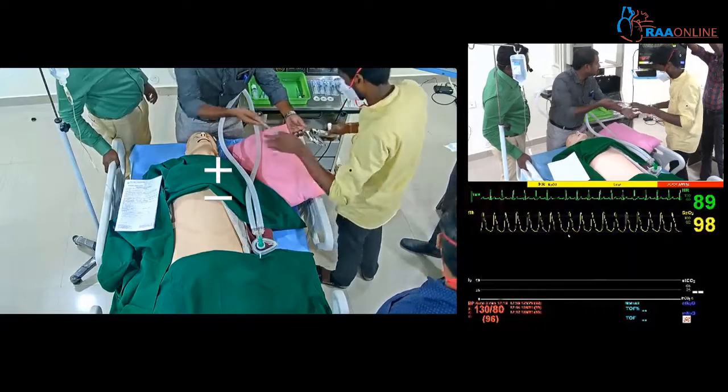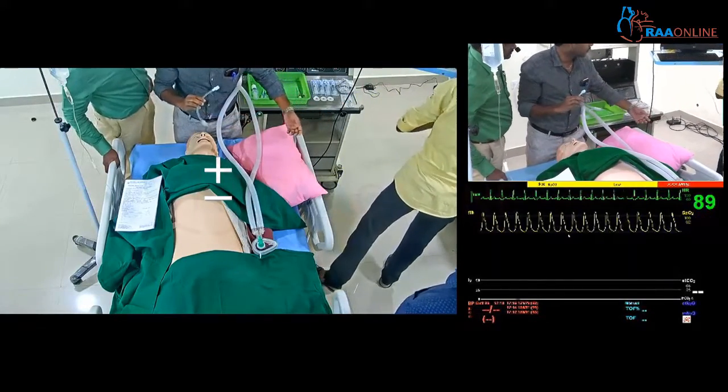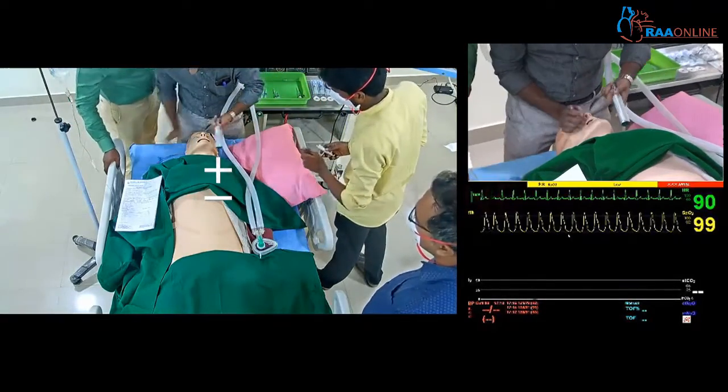Give me another, size 4 blade. We have a size 4 blade. So, what is the previous blade you have used? Sir, I used size 3, sir.